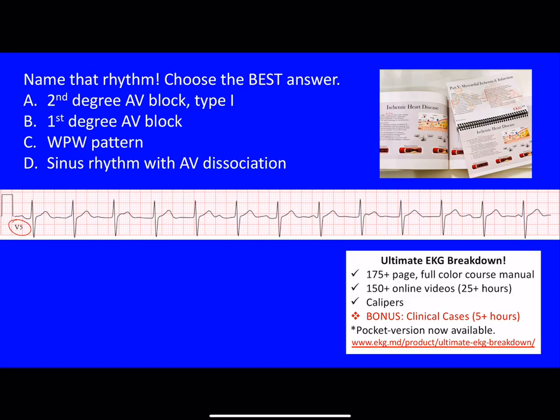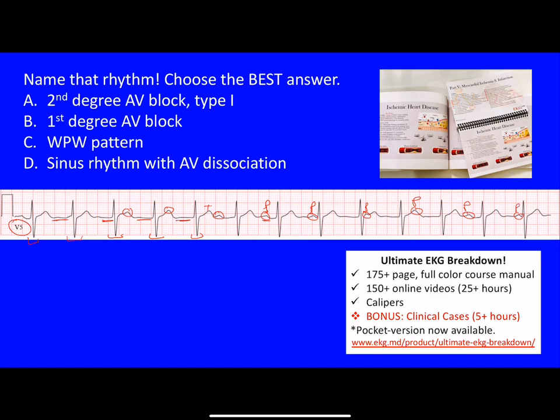Looking at this rhythm strip, we have these ventricular complexes — these RS complexes. As you notice, we don't really see any P waves here initially, and then all of a sudden we have our T wave. Then we have this wave popping up — one here, one there at the end, one coming somewhere in here, and so forth. You can see this hump coming probably at the top of the T wave. These morphologic changes in our T wave — those are actually P waves popping up throughout our rhythm strip.